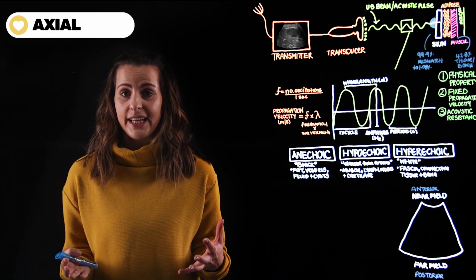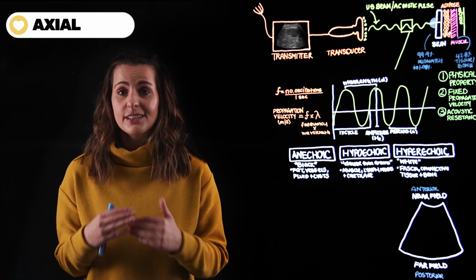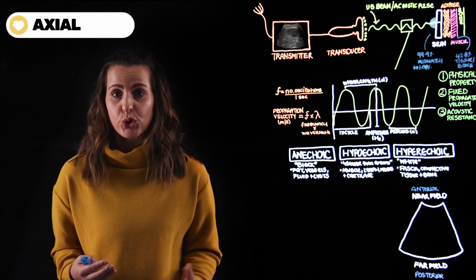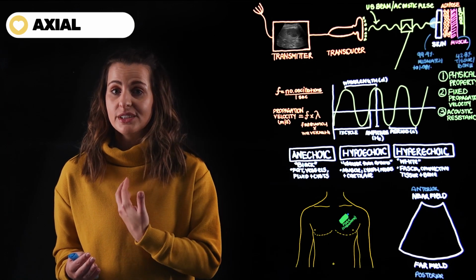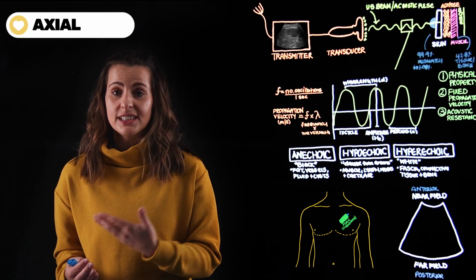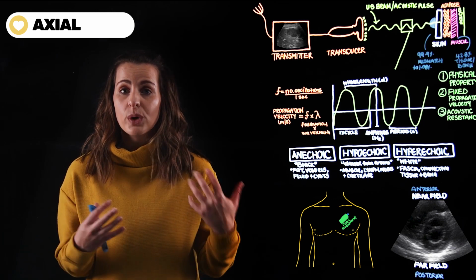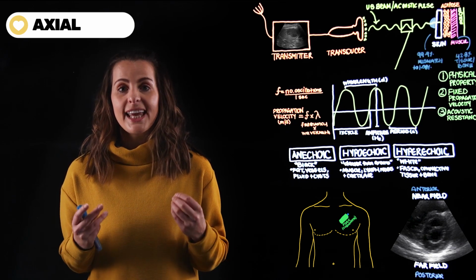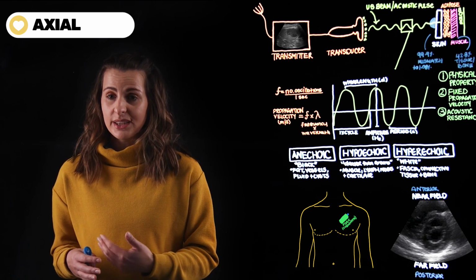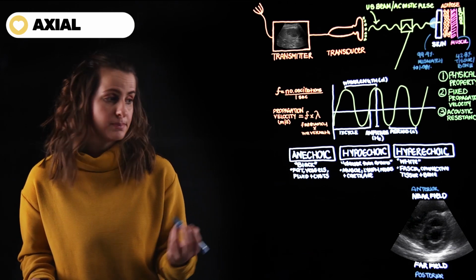The next anatomical plane to consider is going to be our axial or transverse plane. And remember, this is the transverse plane through the heart. This is represented then by our parasternal short axis view. So we then rotate the probe from the long axis position to the patient's left shoulder, as indicated on the image below. You will also remember on this cross-sectional view, we're looking at the heart bottom up. So the indicator marker is going to be on the patient's left side. And consequently, this is then on the right side of the image, as indicated by that indicator dot.